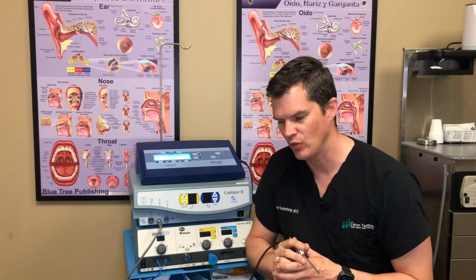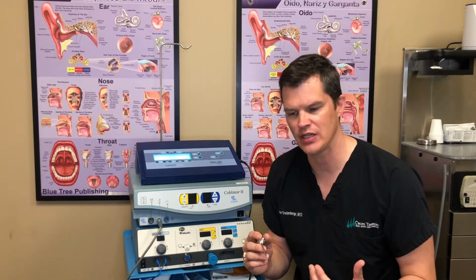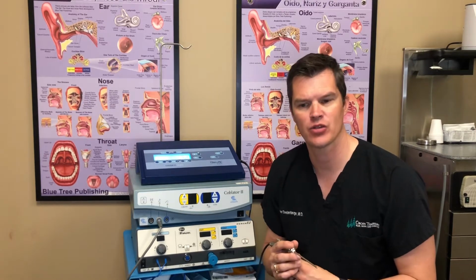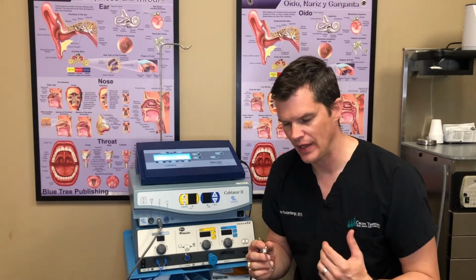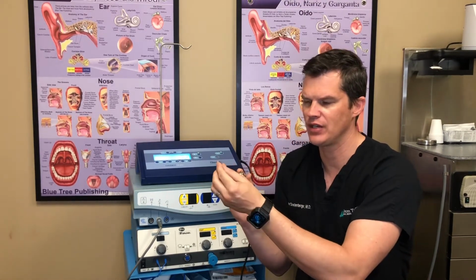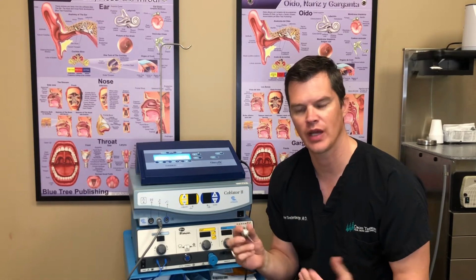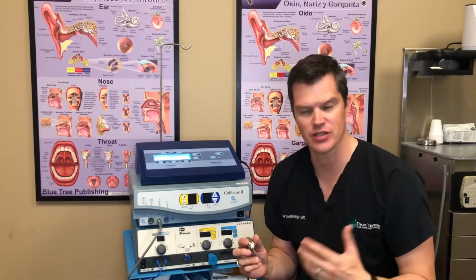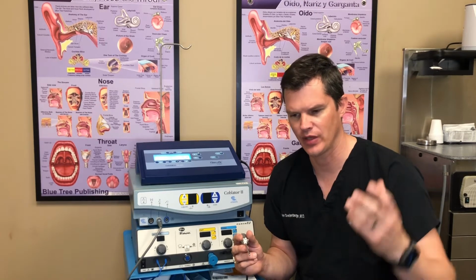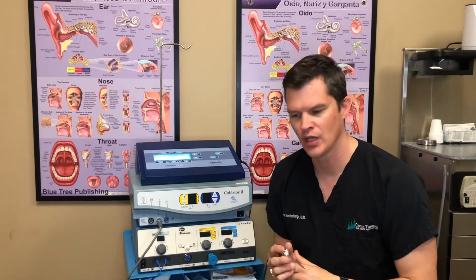But when this came out in, I believe, the late 80s, it really revolutionized our ability to do sinus cases and, to a certain degree, shrinking of the turbinates and things like that. Basically, it's a little stick that has a little cutter on the end of it, and it sucks and cuts at the same time, kind of like the Flowbee, which I've never actually had cut my hair. But there's this hilarious hair cutting tool back in the 90s, I think, where it would suck and cut the hair. So this is the Flowbee of the nose.